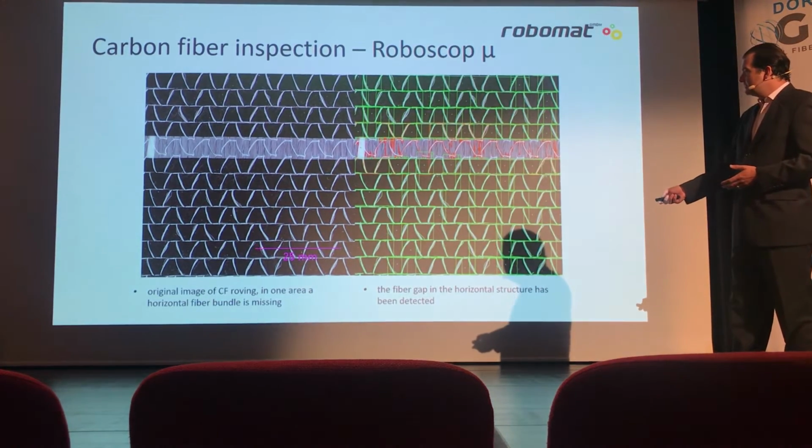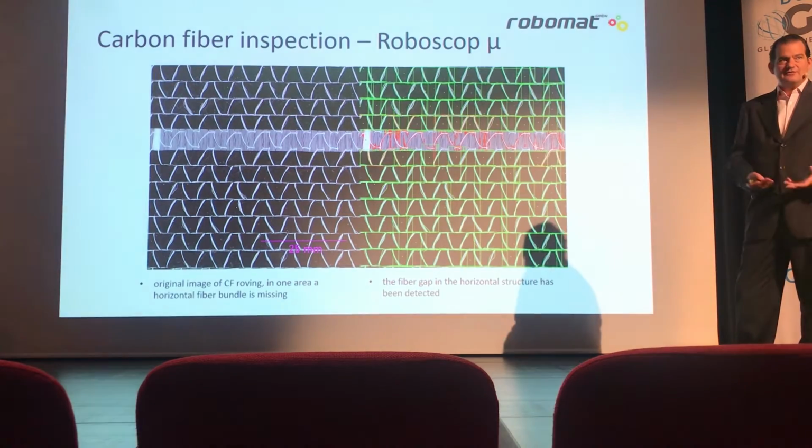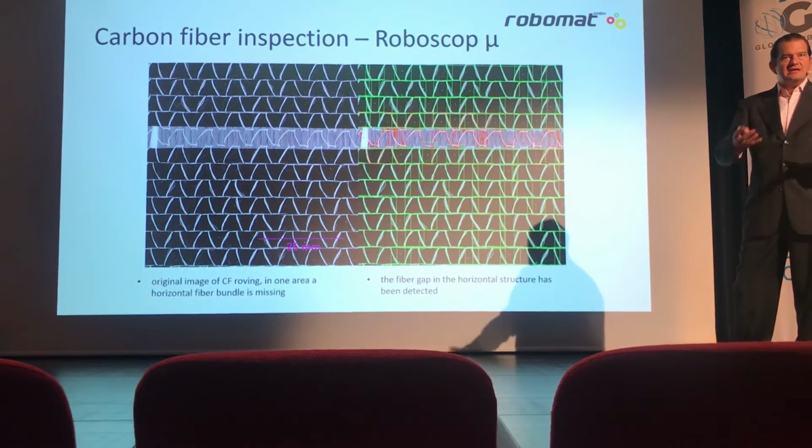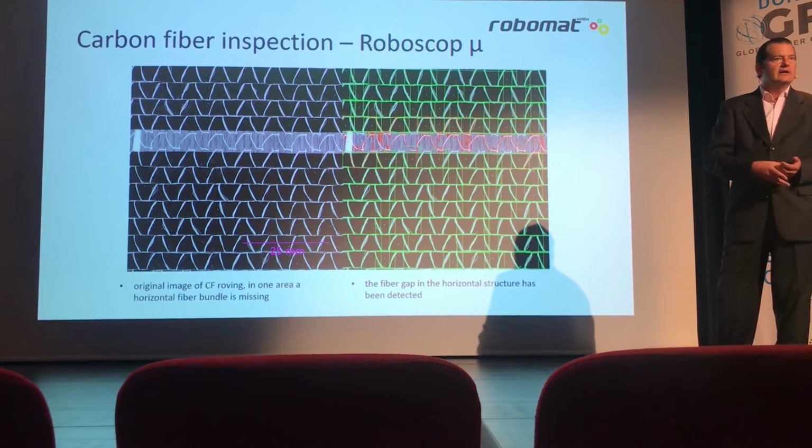But again, as you can see, 25 millimeters across. We are working at near microscopic levels, but with the ease, basically, of a telephone where you can scan up and down as you wish.